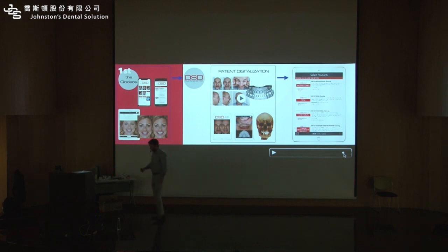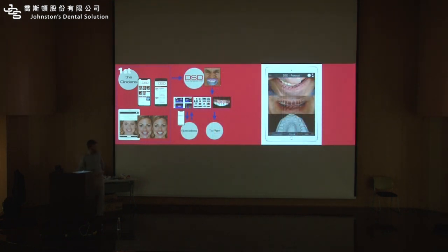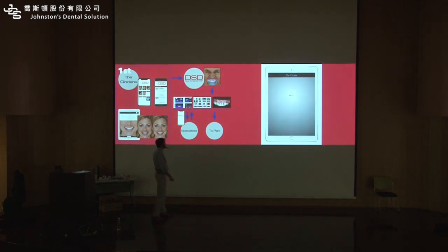Okay? That's it. You see there's many things here, but don't worry. Start with the simple stuff. Smile design. Okay. So the case comes to us. We design a smile. Comes back to you. You approve. Then you can share with your team. So in between the first appointment and the second appointment, you are treatment planning the case based on this smile design.